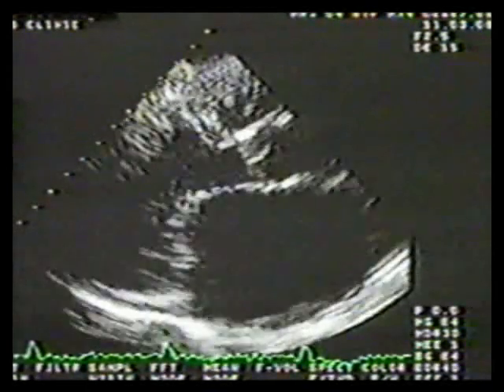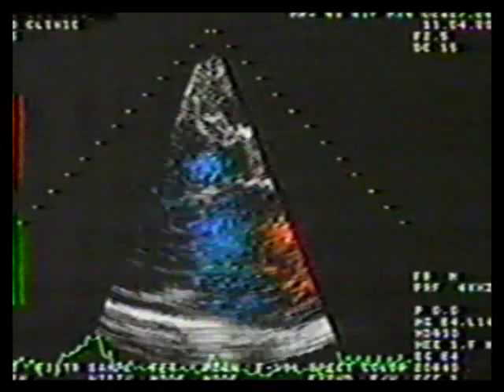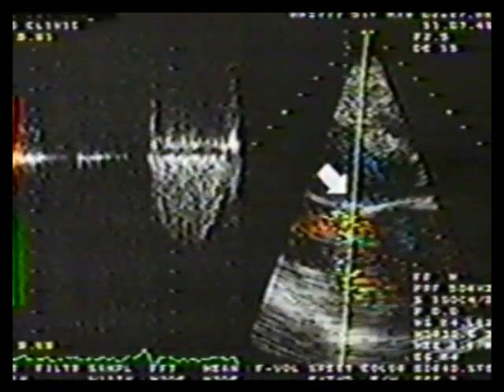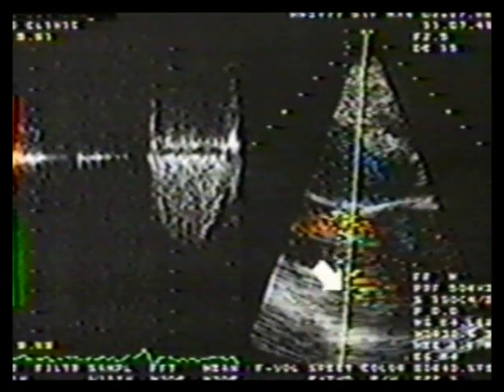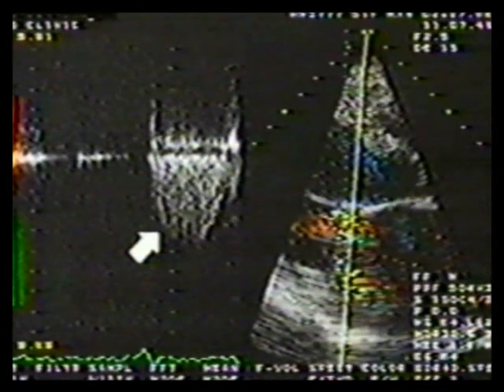In a parasternal long axis still frame, this patient has prolapse of the anterior mitral leaflet with a small unsupported flail segment. With color flow added, the flail segment of the anterior leaflet has baffled the regurgitant jet posteriorly along the posterior mitral leaflet. A continuous wave cursor directed through the mitral jet produces a strong signal typical for mitral regurgitation.